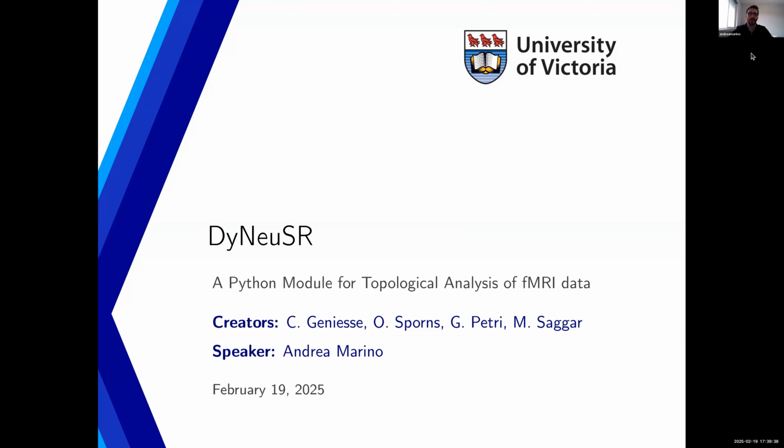Today I will talk about DyNeuSR, which is a module for topological analysis of functional magnetic resonance imaging. So whether you are a neuroscientist excited to try new methods or a topological data analyst seeking to extend their range of applications, this is the right tutorial for you.